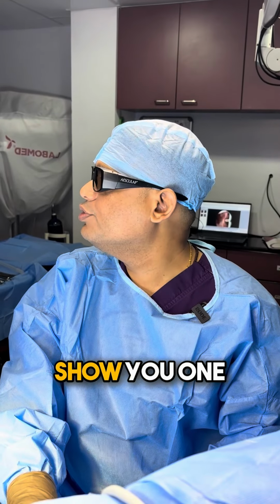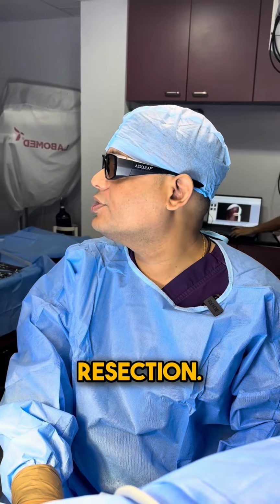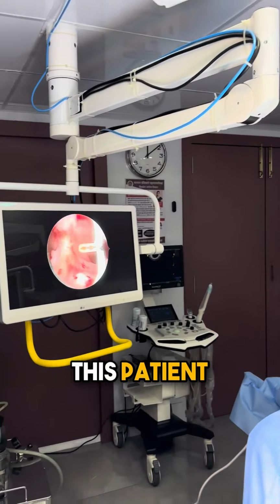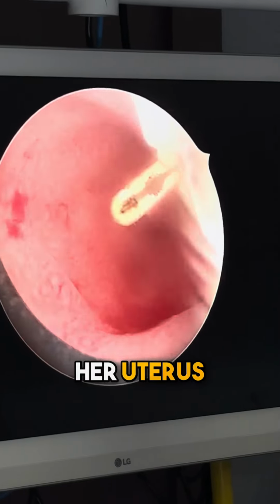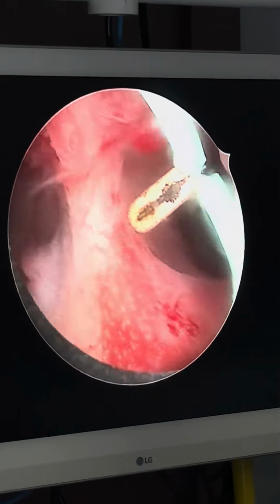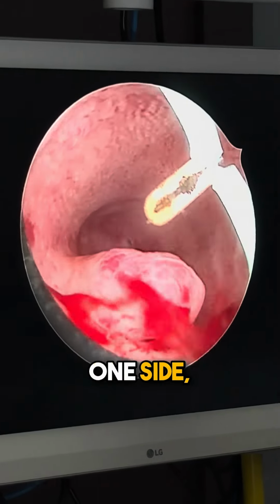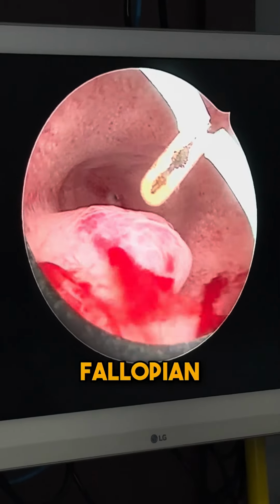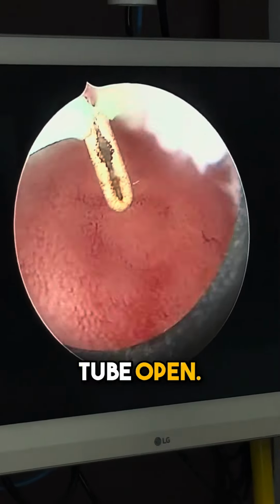So today we are going to show you one very interesting case, which is uterine septum resection. Look at the screen. This patient is having a huge uterine septum. On one side, her uterus is literally divided into two halves because of this septum, wherein on the right side the patient has her fallopian tube open, and on the left side also the patient has her left fallopian tube open.